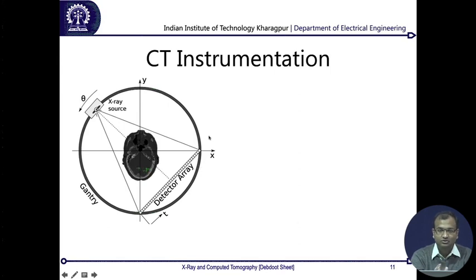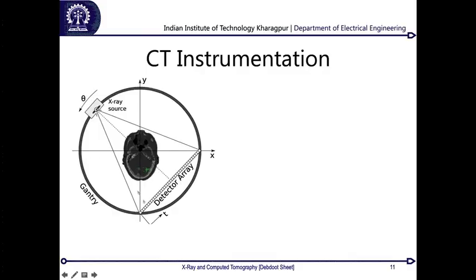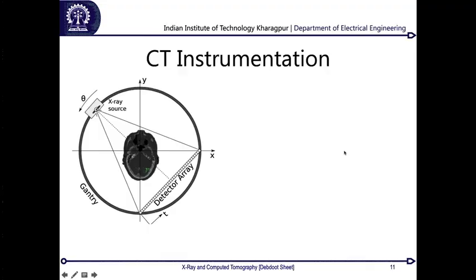Okay, this you can do in 2D space, and now what you have to do is keep on rotating this pair of source and detector array. It keeps on rotating in this way, and you get multiple projections. From each of these projections you can backtrack and iteratively reconstruct your whole object. So that comes down to the CT reconstruction, which we are eventually going to do.